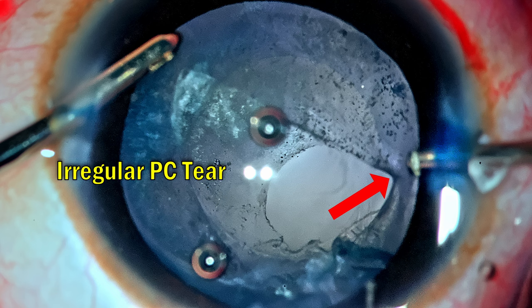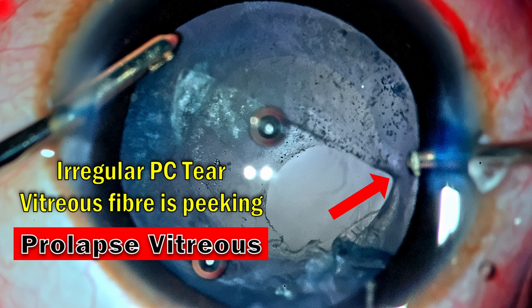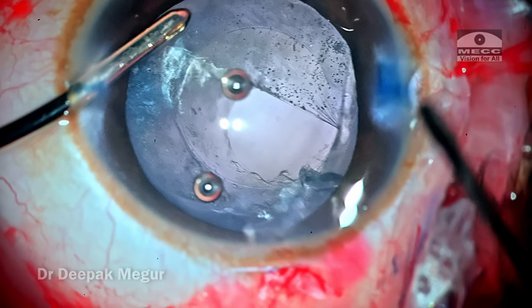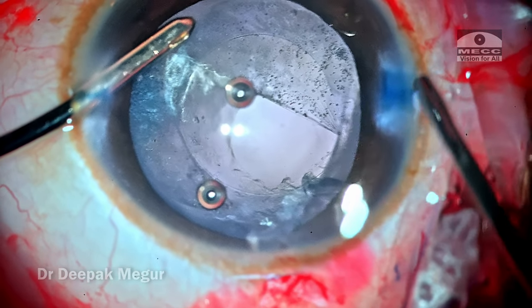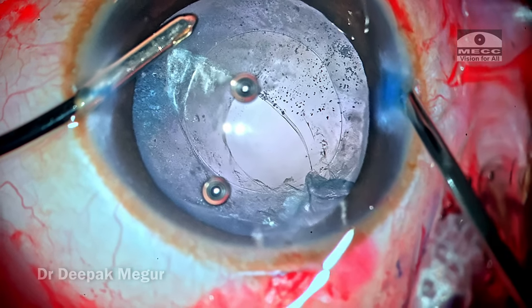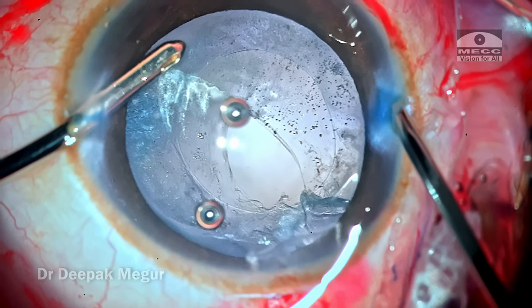The posterior capsular tear looks irregular and it appears to be peaking towards the side port incision — this is a definitive sign that vitreous is prolapsing and heading towards the side port entry. The vitrector is pulled out, held in the wound itself, and the cutting and aspirating action is begun. Once that prolapsed fiber is taken care of, we can see that the posterior capsular tear becomes regular and the vitreous fiber that was tugging at it has been released.